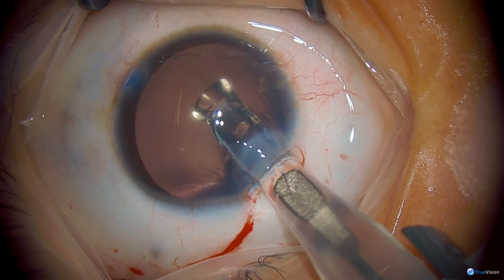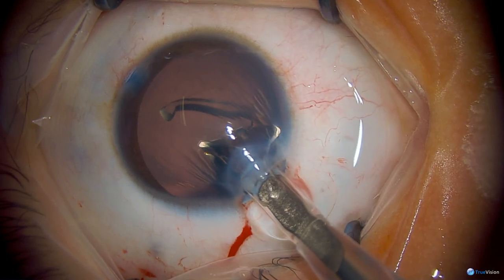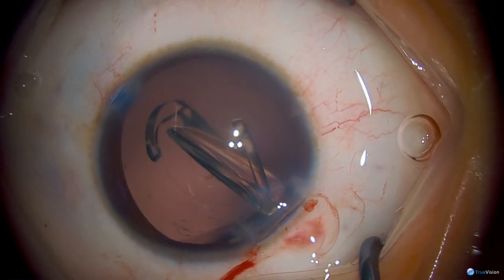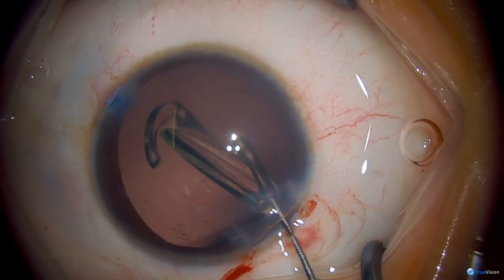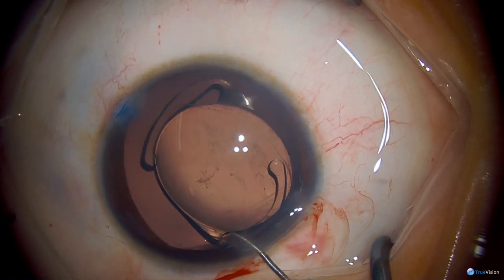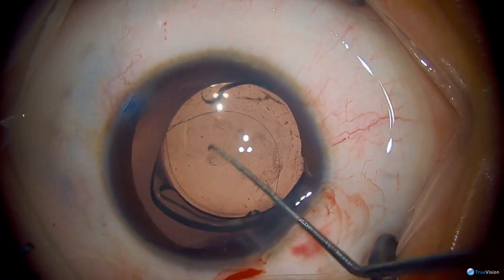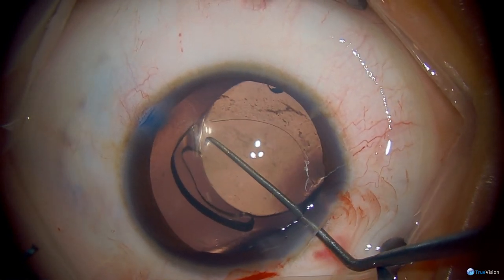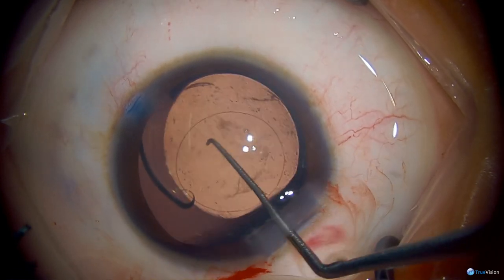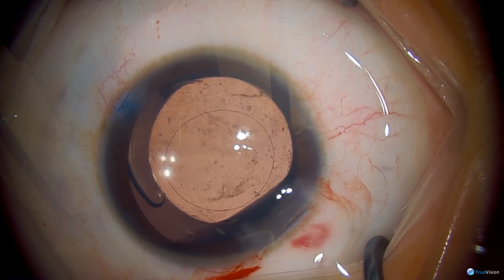Once those two fragments are removed, you can place more viscoelastic in the eye and go back to a repeat injection. Here you can see that the plunger did not extend onto the surface of the optic like it did with the first implantation. Now that pristine intraocular lens can be easily dialed into position. One of the real benefits of this particular lens for pediatric cataracts is that it tends to open quite slowly and allows you to maneuver into position, particularly if you have an irregular capsulotomy, a small capsulotomy, or even an opening in your posterior capsule.